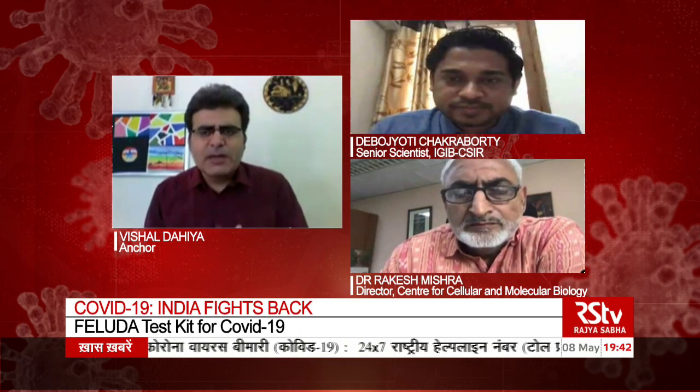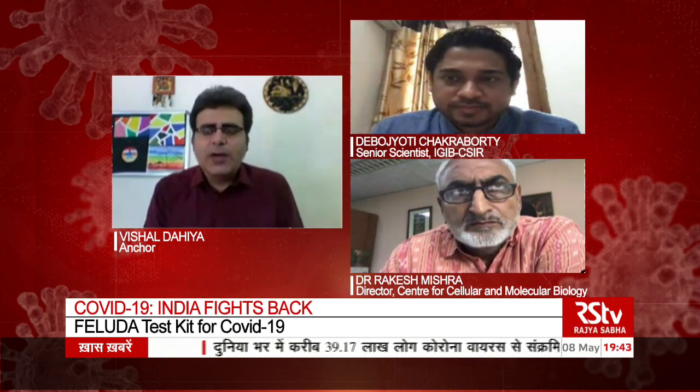Okay, and let's talk about the mass deployment or the mass testing which might be possible with this, which you were earlier referring to. Obviously, cost is one aspect of it, but I believe the other very important aspect here is that you don't need big or heavy machines or equipment to be taken to the interiors or the rural areas. Since this is a paper-based test, it can easily be carried anywhere, and the accuracy is also very effective.